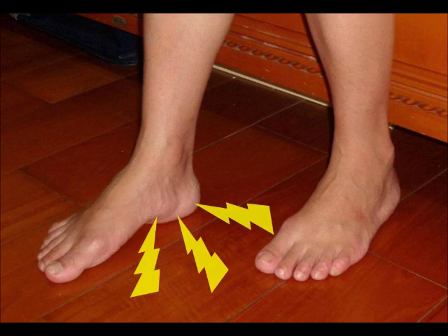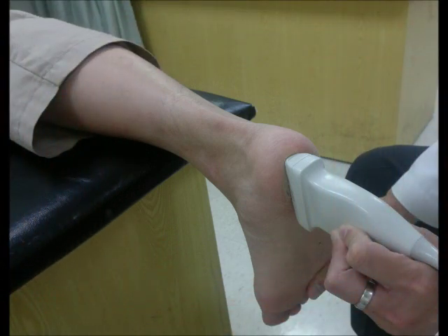Musculoskeletal ultrasound is useful in confirming the diagnosis, especially in patients without typical presentations or who are refractory to prior treatment. The plantar fascia is best examined with the patient prone, hanging their feet over the edge of the examination table. The probe is applied to the plantar aspect of the heel.